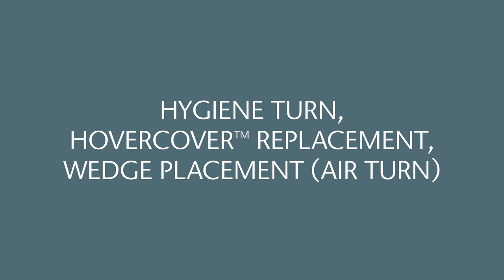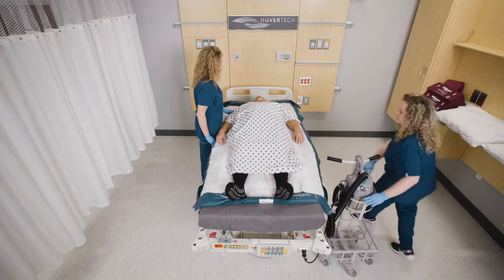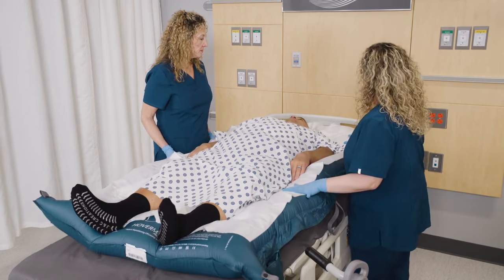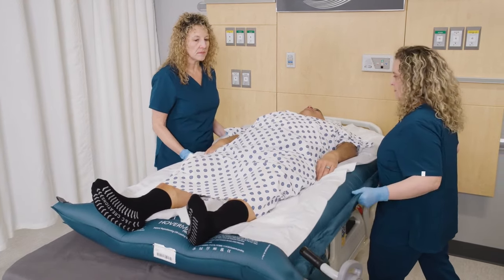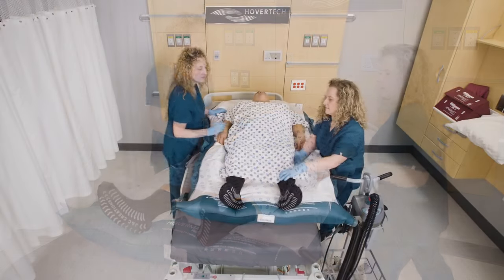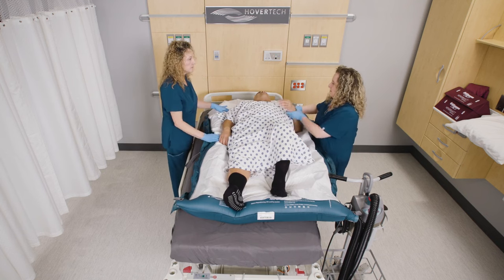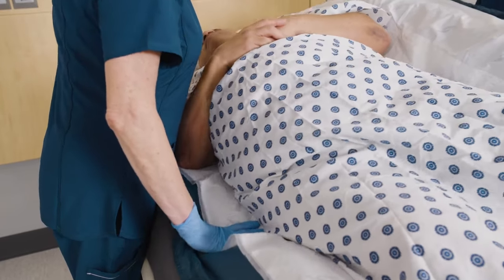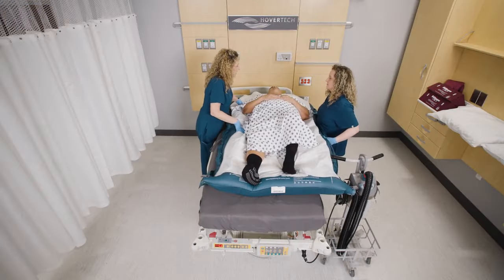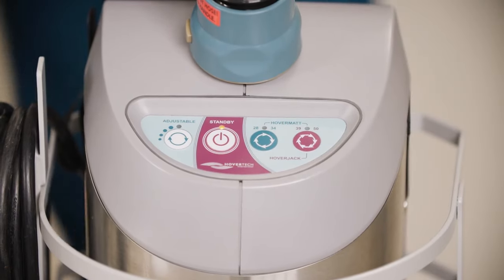Hygiene turn, hover cover replacement — wedge placement air turn. Ensure the patient is centered on the Pro's AIR. With a caregiver on each side of the patient, fully inflate the Pro's AIR. Slide the patient as close to the edge of the bed in the opposite direction of the turn as possible to ensure that when repositioned, they will be centered on the bed. Bend the patient's knee. To turn the patient on their side, the caregiver furthest from the patient will gently push down on the Pro's AIR at the patient's shoulder and hip, while the turning caregiver gently pulls up on the handles. Once the patient is turned on their side, the receiving caregiver will stay with the patient while the turning caregiver presses the Standby button to stop airflow.